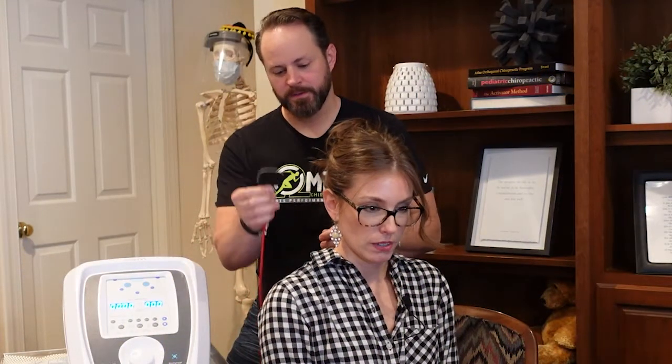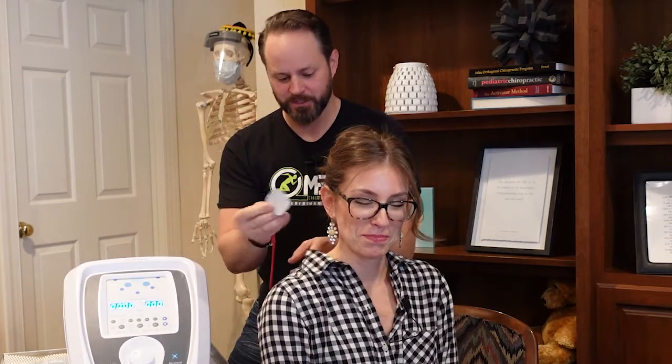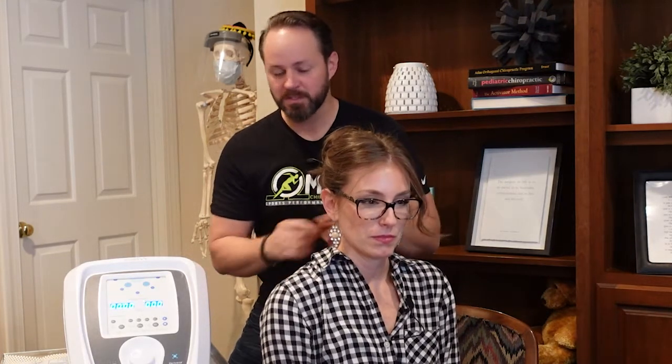Yeah, let's do it. Okie doke. So what are you putting on me? These are called electrodes. I have 2 leads that separate into 4 wires where you put 4 pads, these electrodes that just stick to the affected area we would like to work. So it's not hard. You just kind of stick them on there. There's specific places that we would like.